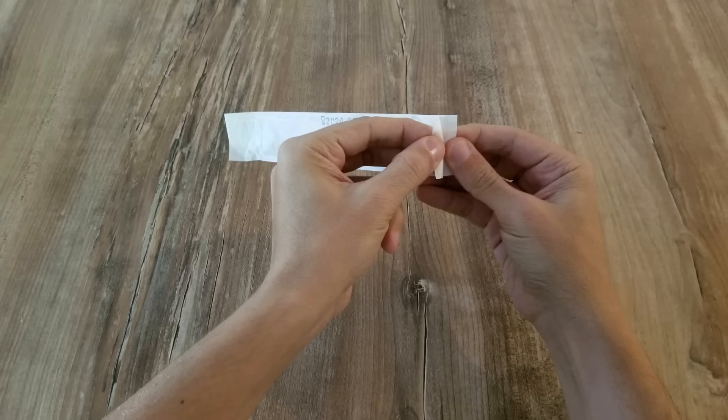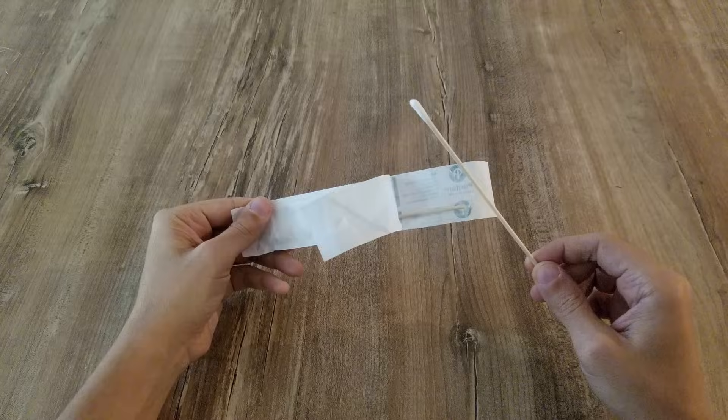Step number 1: Open the package from the end. Step number 2: Remove one of the swabs carefully. Ensure the cotton doesn't touch any surface prior to collection.